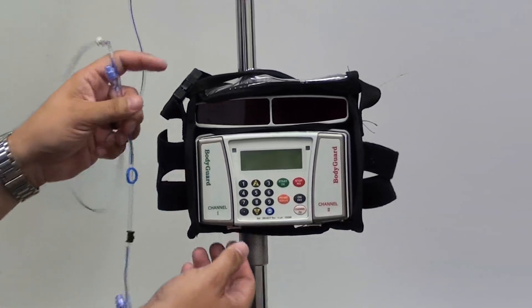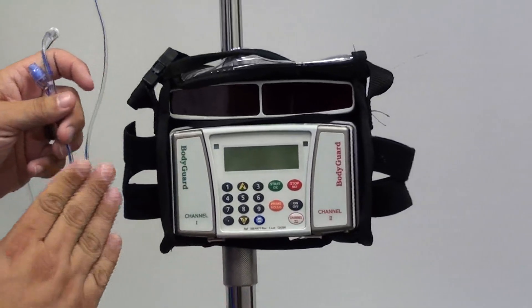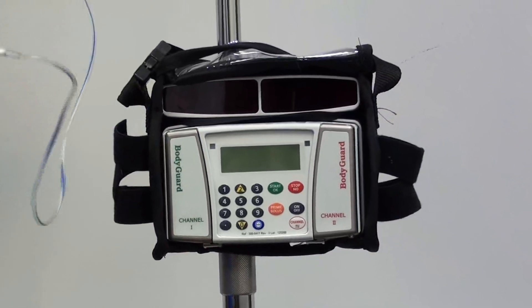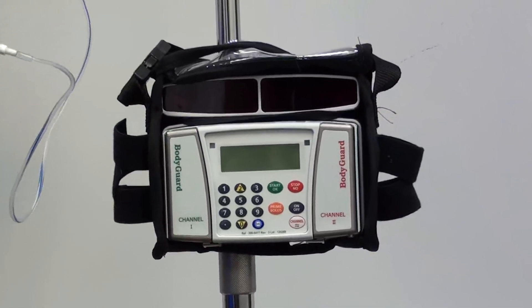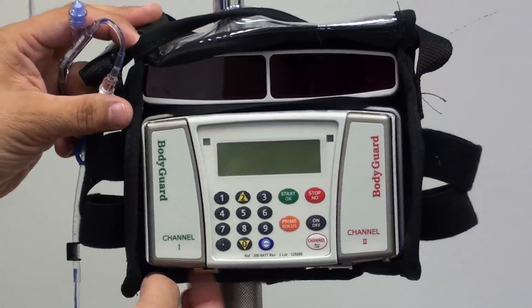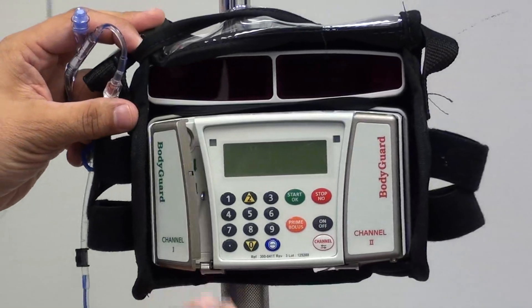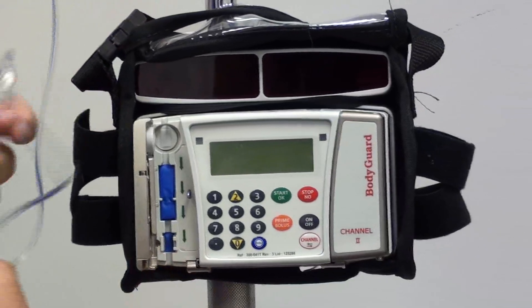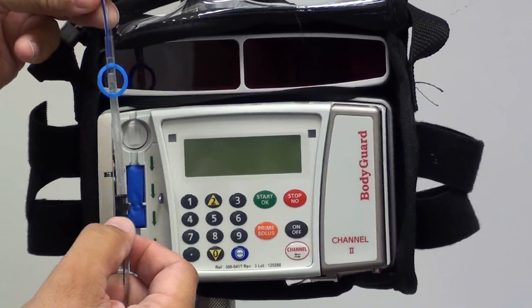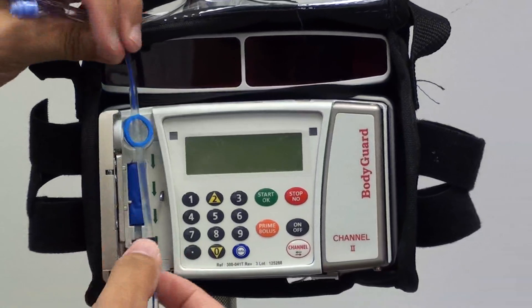First we're going to place the tubing into the pump after it's already been established with the connection in the medication. On the bottom of the pump you'll find a lever to pull which will open the door. The blue ring goes up on the top and the black key is pushed into the bottom.